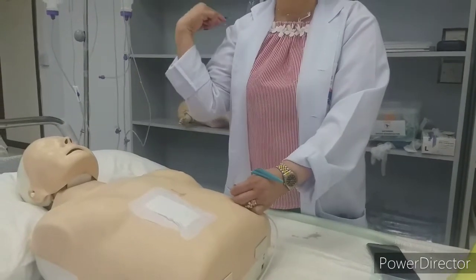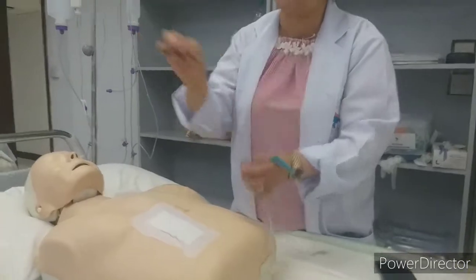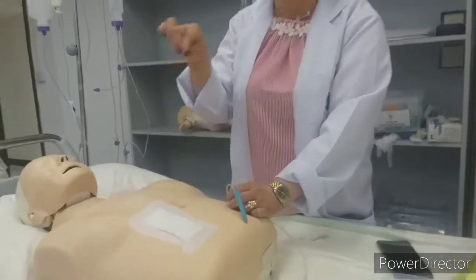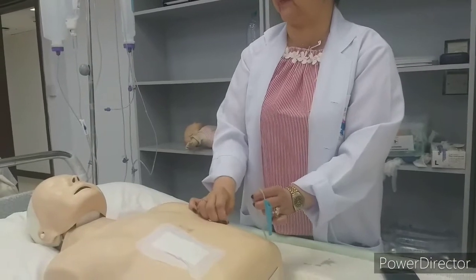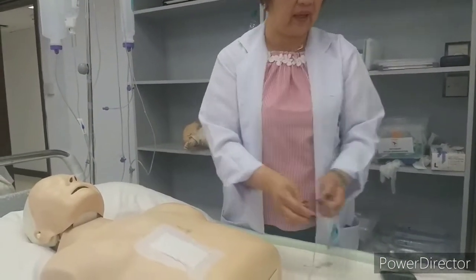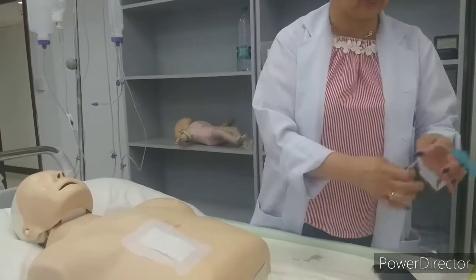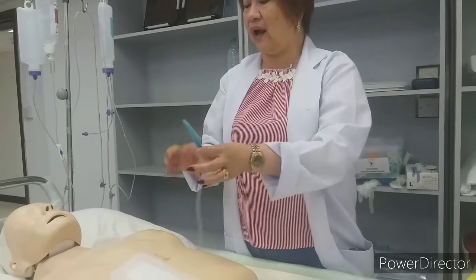Circular. Injection with that insulin, circular. Everything is circular, out. You do not go back and forth. Okay? So this is the PEG. Now, with colostomy, I did not show you the PEG and colostomy. I'll show you. Colostomy care.